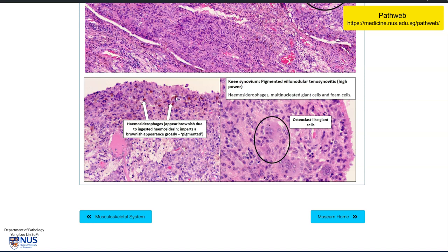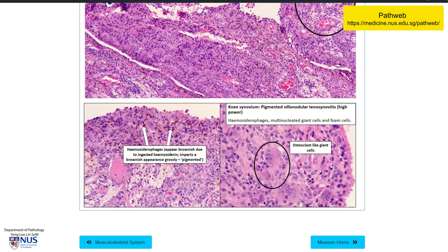Over in this region, you can see these brownish deposits — this is actually hemosiderin. Sometimes this hemosiderin is found within macrophages, and again this imparts the brownish appearance. There may also be osteoclast-like giant cells and some fibrohistiocytic cells in the background. So again, this is a benign neoplasm arising from synovial tissue, and the management is surgical excision.